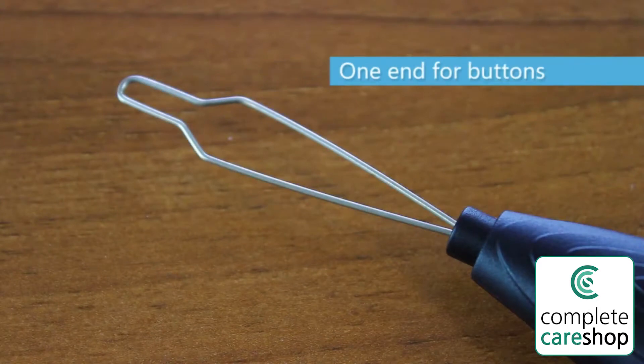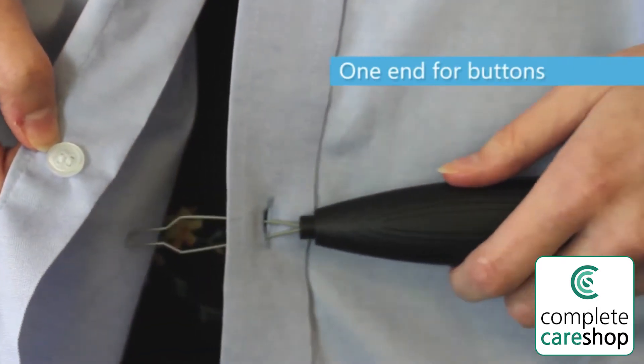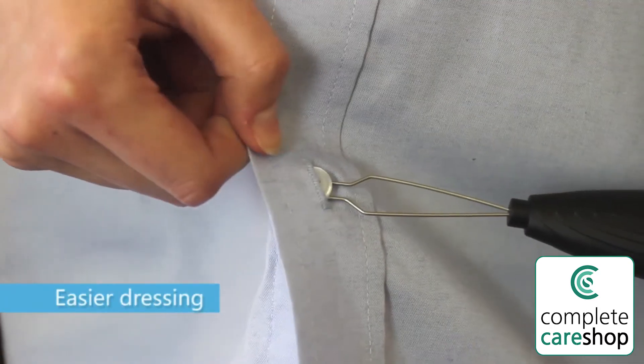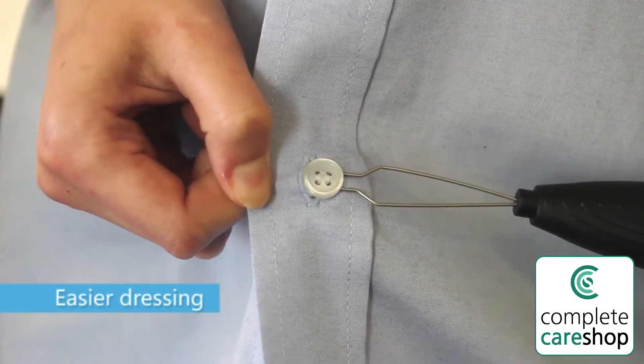To open and fasten buttons, hook the button onto the looped metal end and pull it through the buttonhole. The chunky black handle is textured and easy to grip.